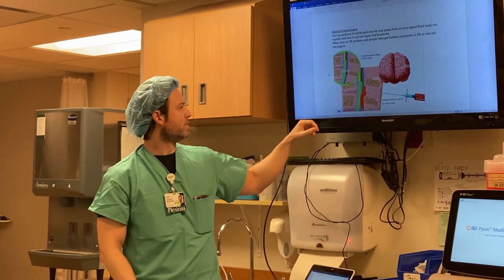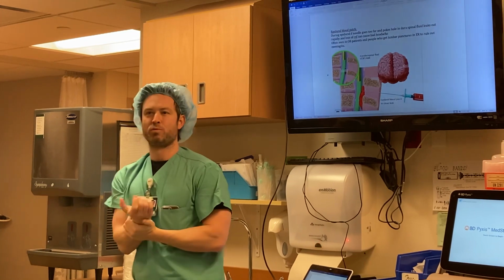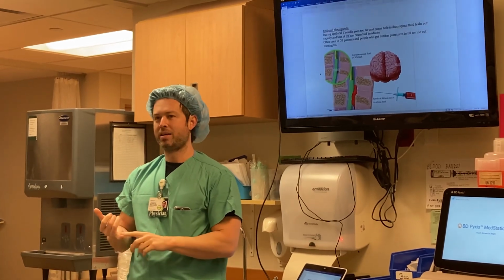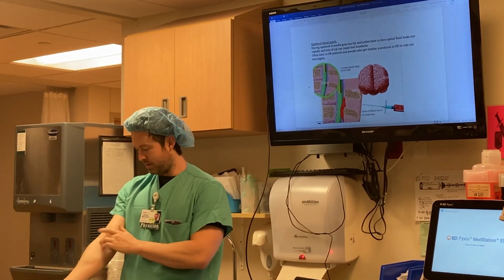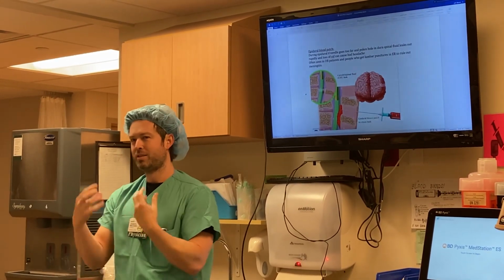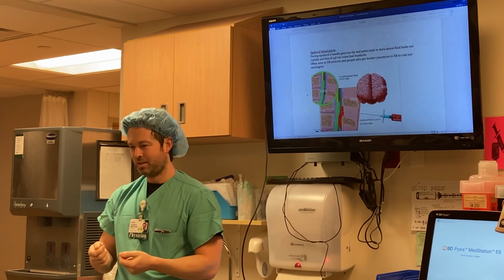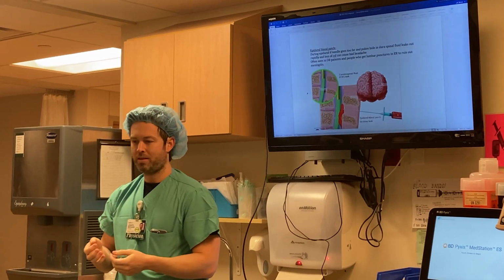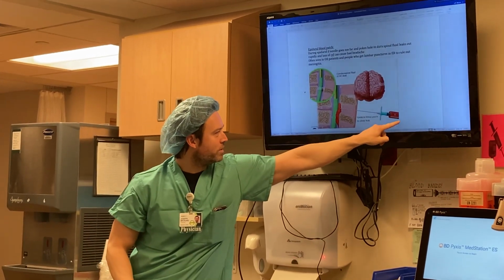So basically what we do is get them in the epidural position that you saw, and then this is kind of unique for you guys because we inject their own blood into them through an epidural needle. So probably the big thing is it all needs to be sterile when we do it. So we'll be doing the epidural, and you guys will, if they have a good AC vein or something, sterilely prep that, put maybe a couple sterile towels around it. You guys will put on sterile gloves, drop a butterfly and syringe into the field and sterilely get usually about 20 cc's of blood if we can, and then you'll hand that off to us, and then we inject that. So basically, that's the syringe of blood you hand off to us.